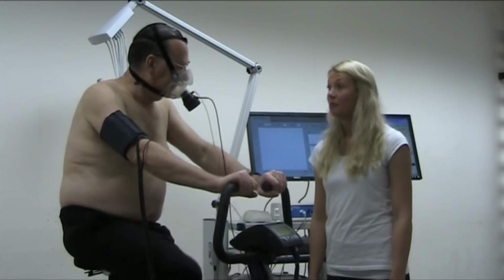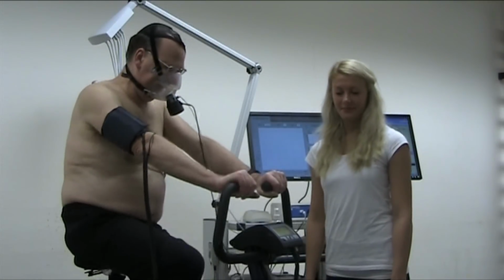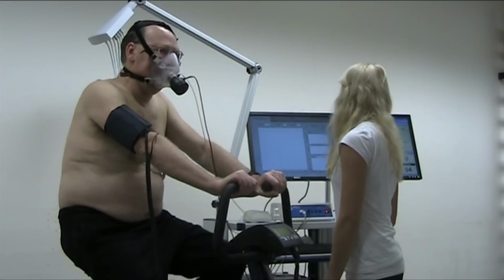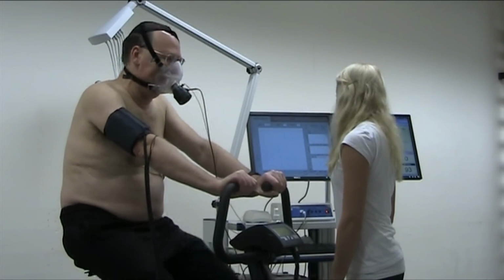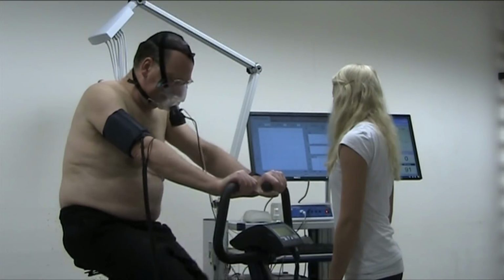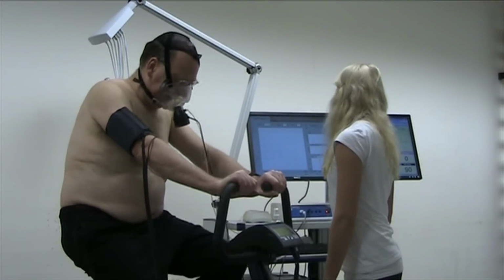In the heart rate box, you can follow the changes within the heart rate. The heart rate should increase with exercise. The ventilation shows the minute ventilation measured in liters. This is expected to increase during exercise.